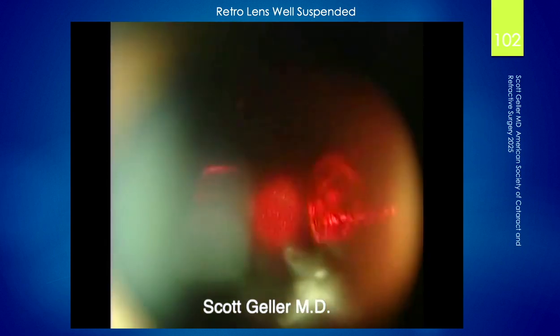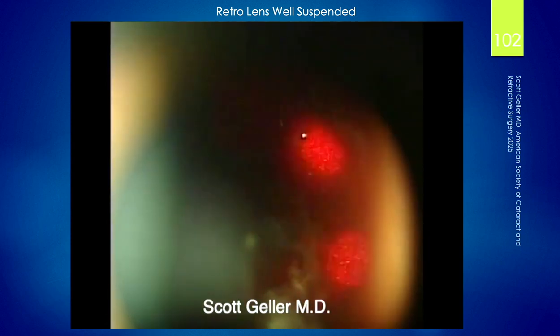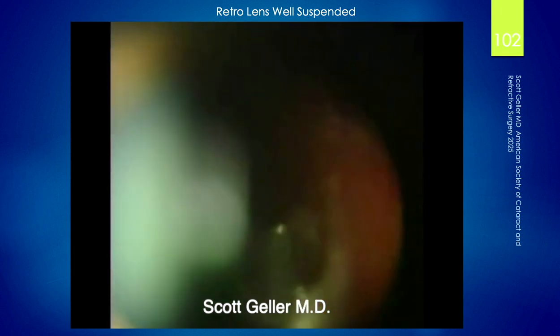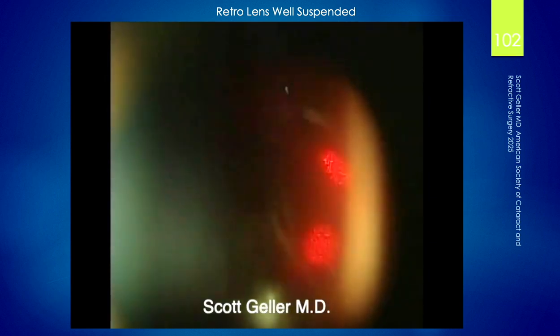Oh, there we go. Don't dislodge it too much. You don't want that to go in front of the fovea. There we go. Don't sweat the little stuff. There we go. Cut those strands. Happy patient, happy doctor.